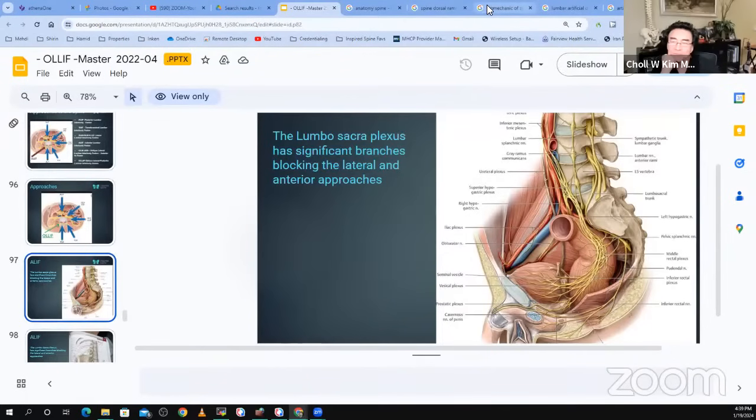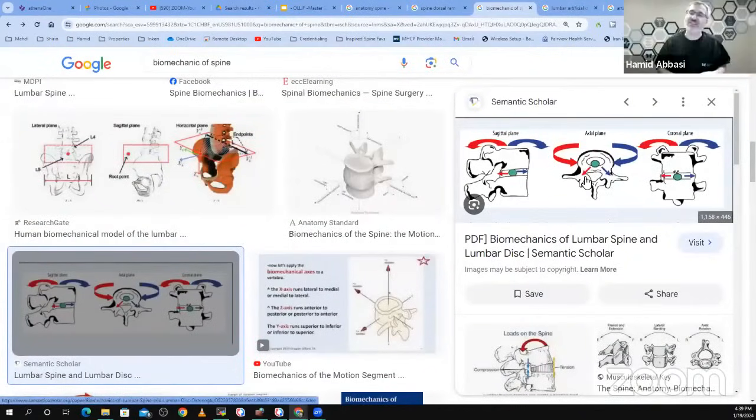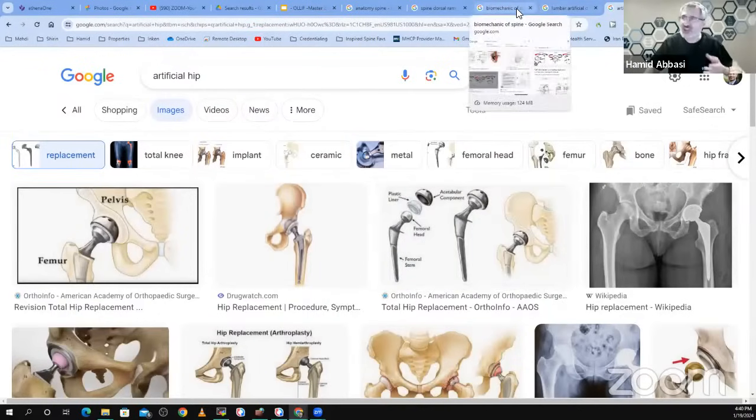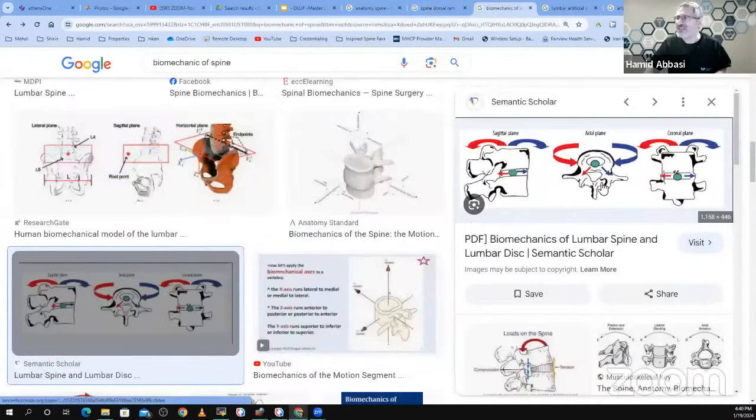German. But one of the reasons they were thinking that their artificial disc failed is because, as you said, like in the joint, like in the hip, you have a center of rotation, you put it in, and you attach the muscle, or maybe sometimes you don't even cut them. In the spine, just to get there, you have to detach lots of muscle, but once you're there, you put something in that has a fixed center of rotation, but in reality, the center of rotation in our spine is not fixed. It is more a shock absorber than a joint.